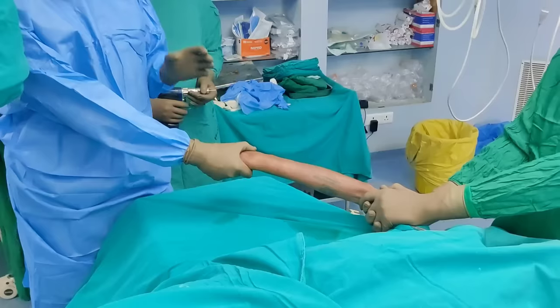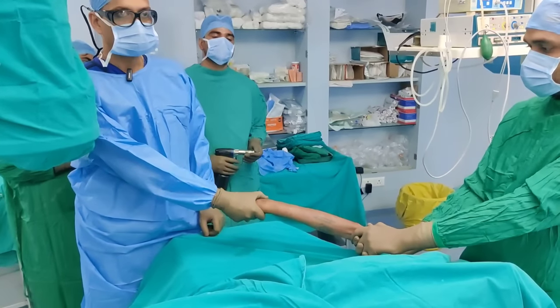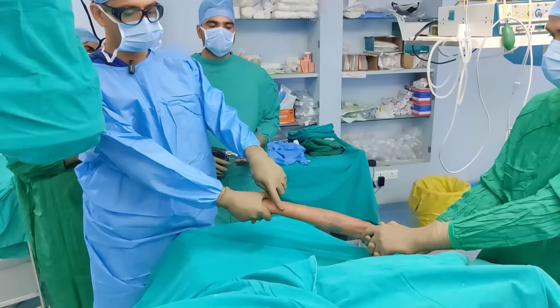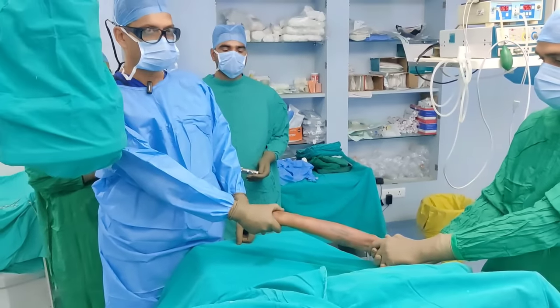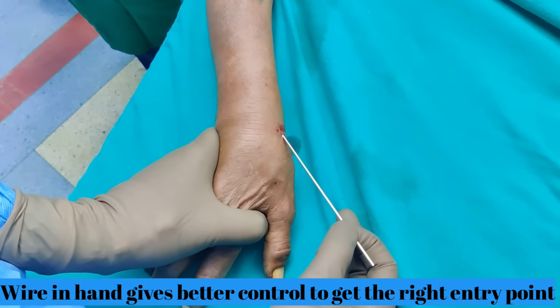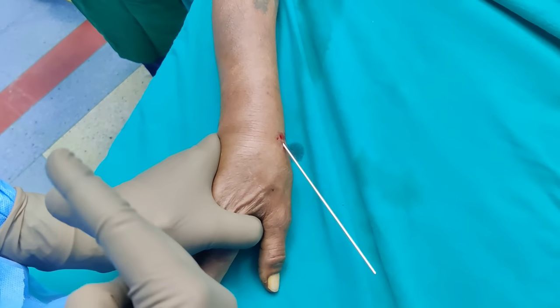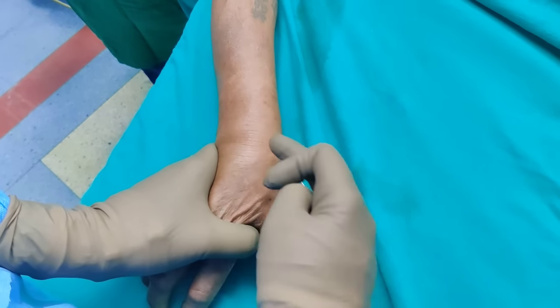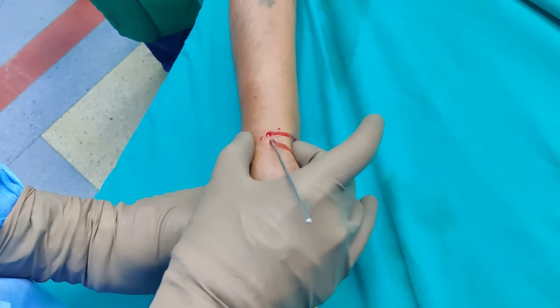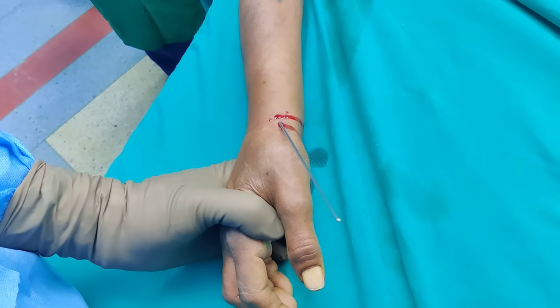Once you are happy with your fracture position — that you have gained radial length and radial inclination — the first wire you will pass will be through the radial styloid. Once I have checked it on the C-arm and the position looks good, I am going to pass my first wire from the radial styloid catching onto the ulnar cortex of the proximal radius. I take the wire in hand and try to locate the tip of the radial styloid. You have to make sure of two things: the direction is good on AP, and on lateral the wire is in the center of the radius.